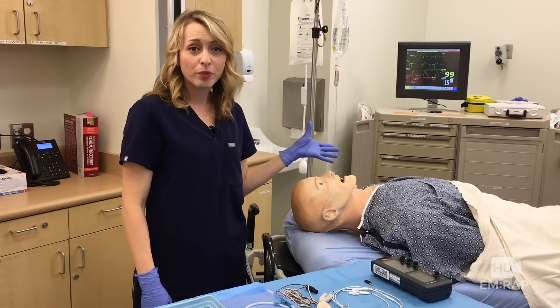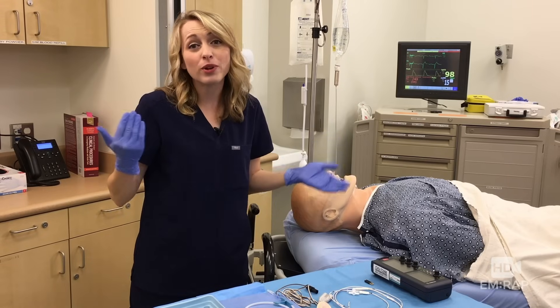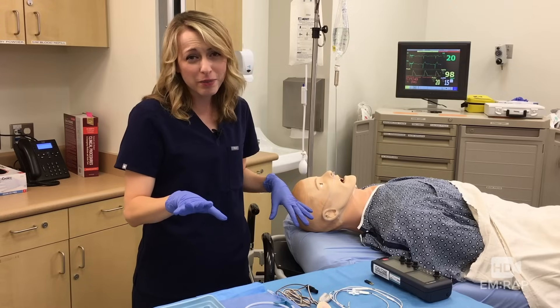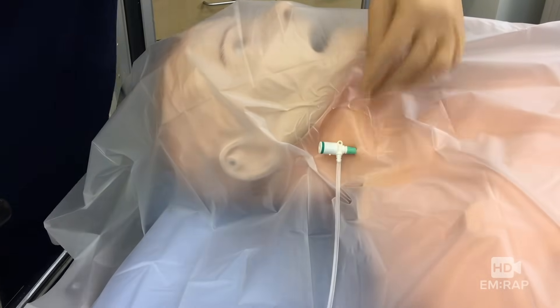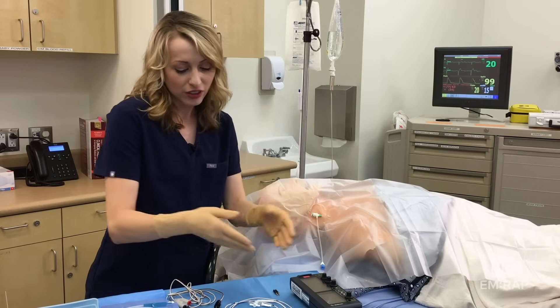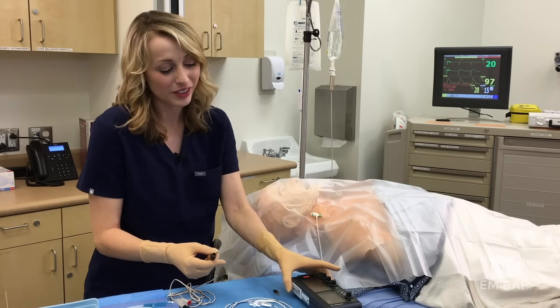Once you consent your patient and have an informed discussion, you're going to sterilely prep and drape your patient, and then put in that right IJ line. Once you've got your cordis in the IJ, remove the wire and the dilator — you can do this all in one motion. Plug the connecting cable into the pacing generator. This connecting cable is typically sterile; the generator is not, so you want to have a non-sterile assistant help you with this.